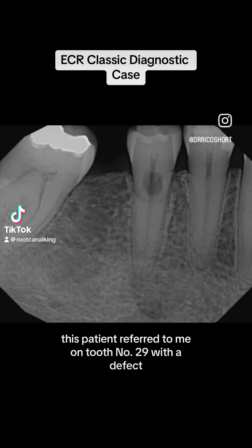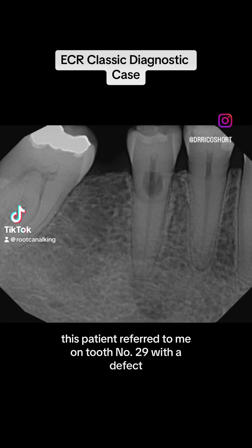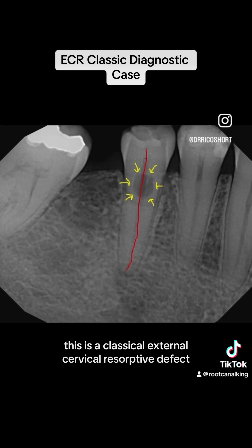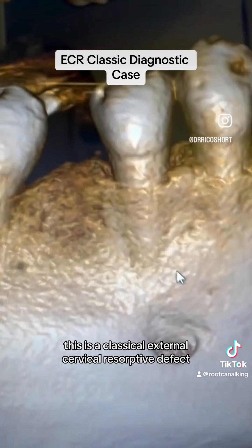This patient was referred to me on tooth number 29 with a defect. If you look closely, this is a classical external cervical resorptive defect.